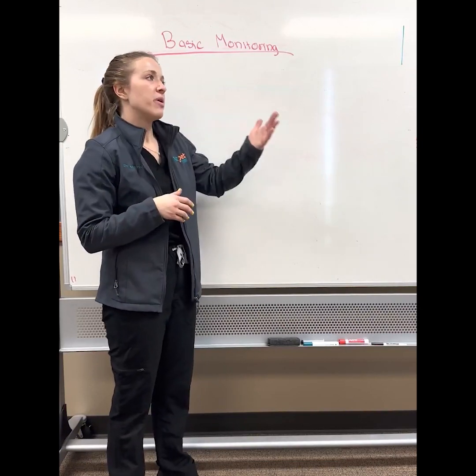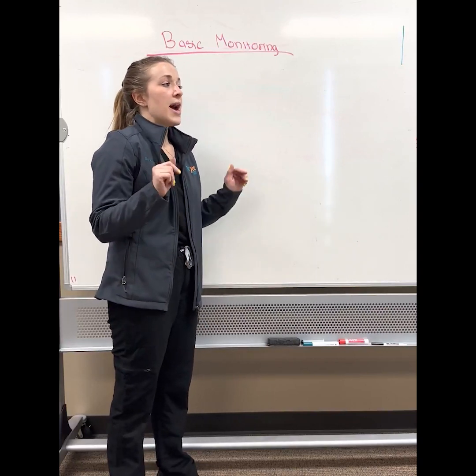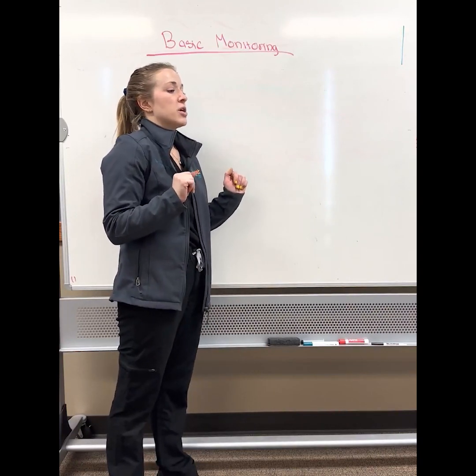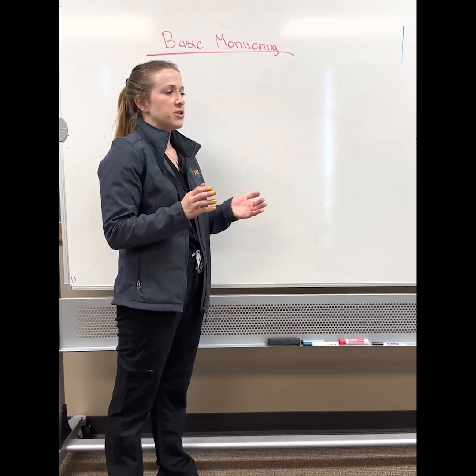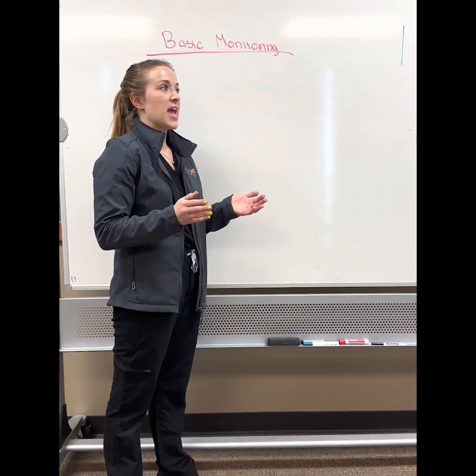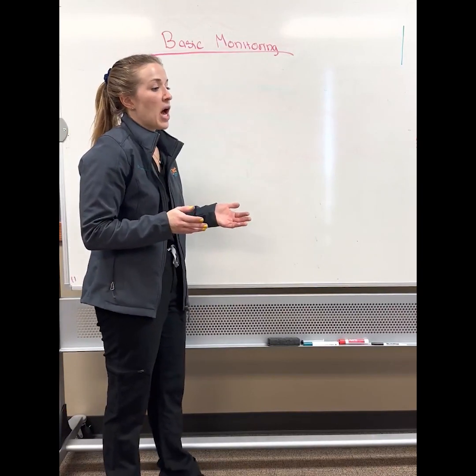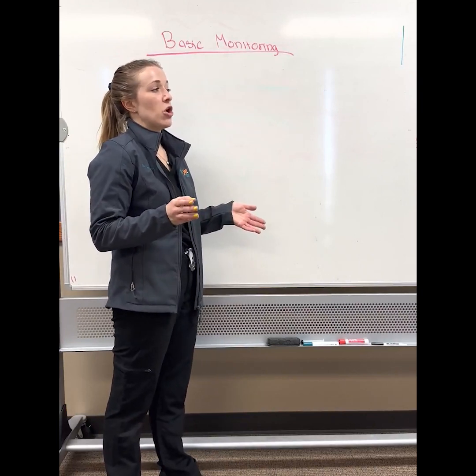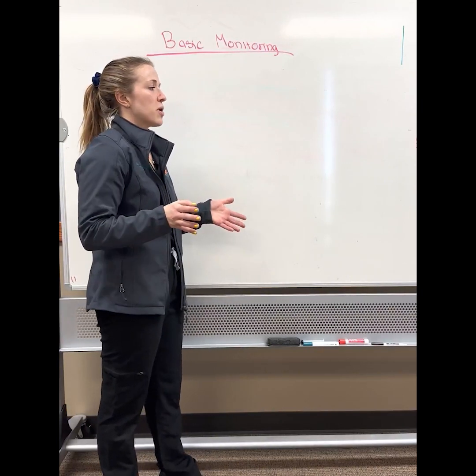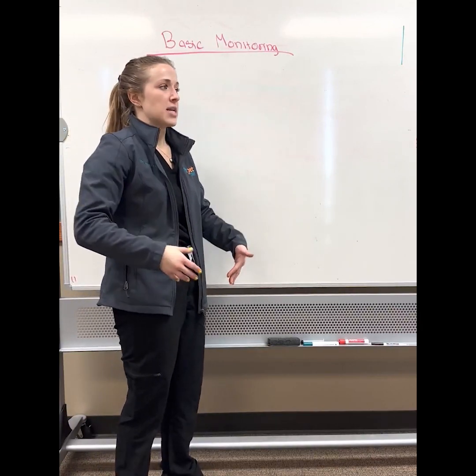If the patient is above 103 degrees, I typically start active cooling. Now, if your patient's temperature increases 1 degree for every 5 minutes they're anesthetized, and they're panting, and they're tachycardic, and their CO2 is really high, they might have a disease called malignant hyperthermia, and you should let someone know and we will try to fix it.